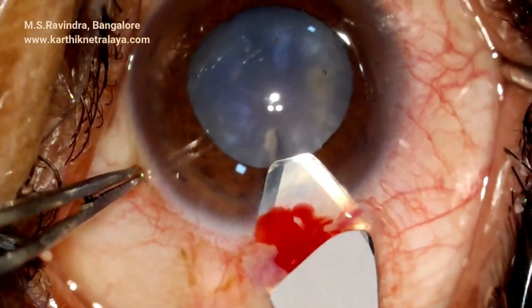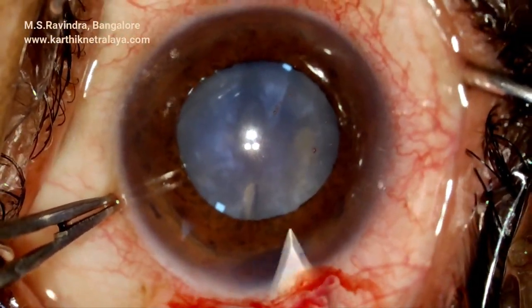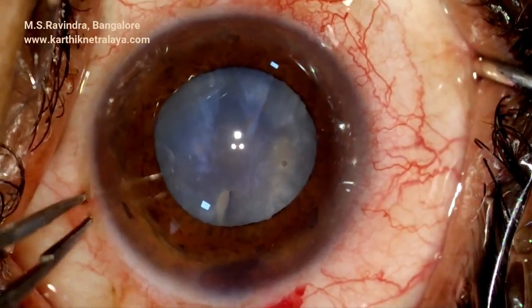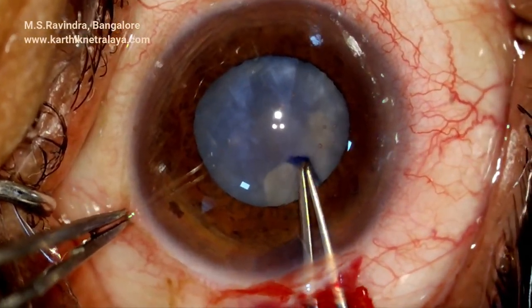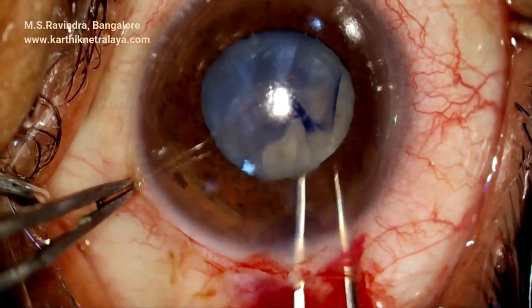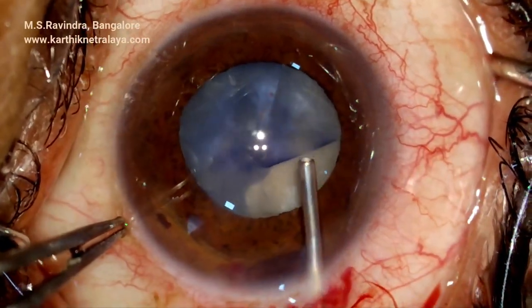One side of the incision is enlarged. It is a hematrapezoid incision — this is to facilitate adjustment of the surgically induced astigmatism (SIA). The capsulorhexis is made larger.